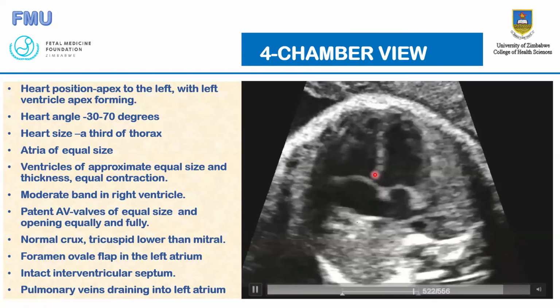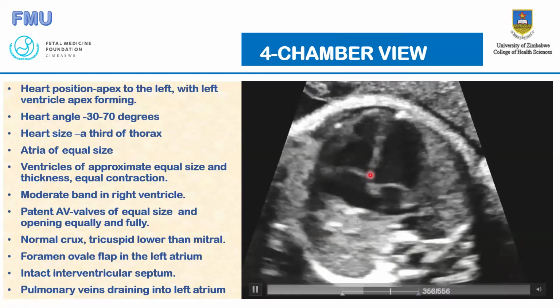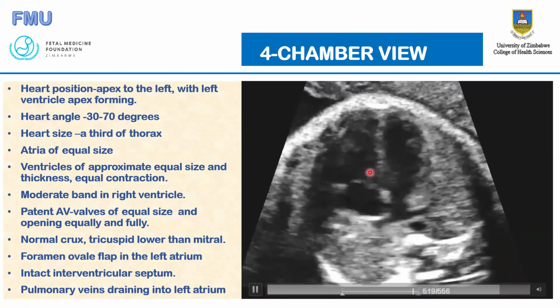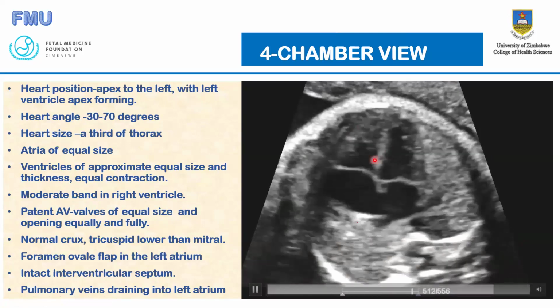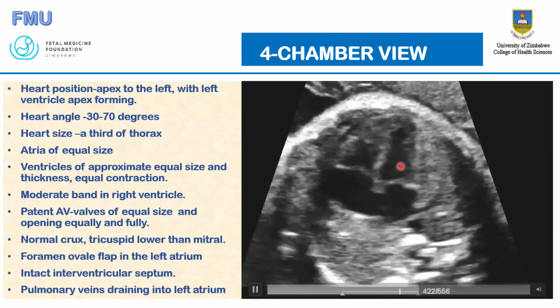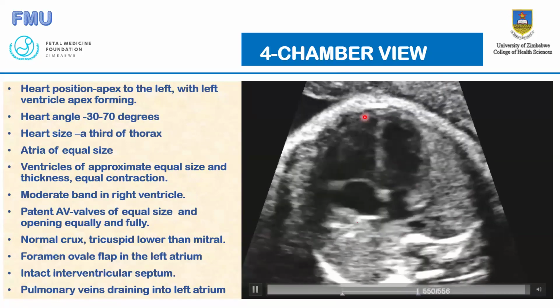Ultrasound doesn't image this part well because of the position. You need to horizontalize the septum and look at it, because the ultrasound only shows clearly structures it is in contact with at 90 degrees. Like you can see, the valves are coming out nicely because they are at 90 degrees to the beam there.